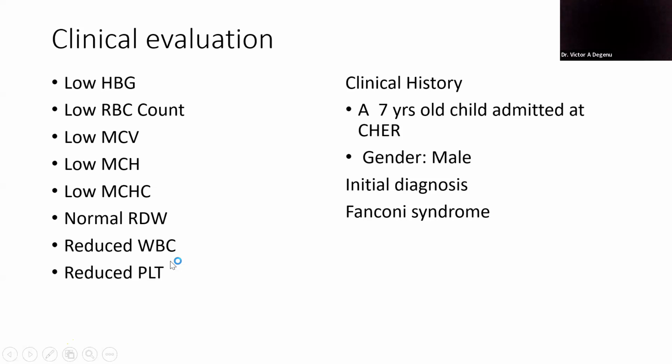So all of them are low. So what can you say? What conclusion can you draw from all these low things? All these low parameters, except RDW, which is normal. So what can you say?